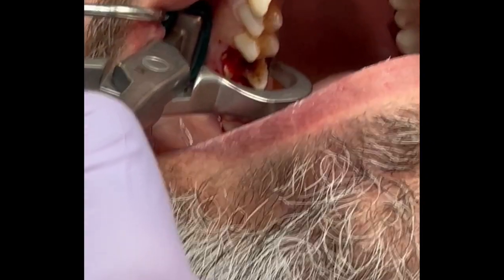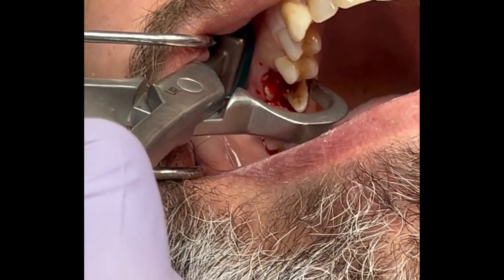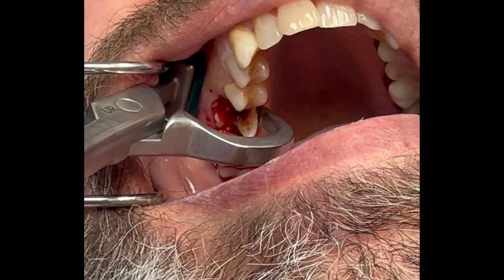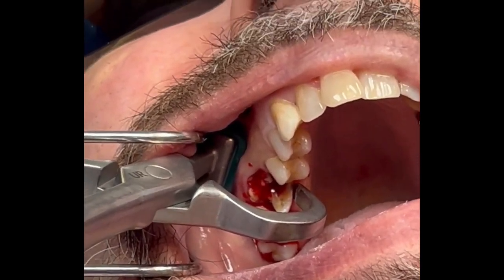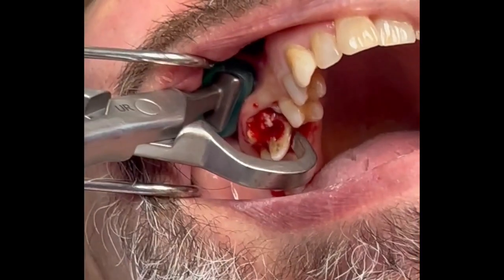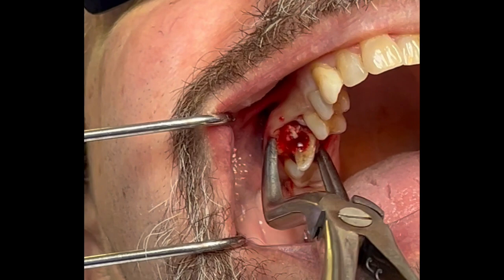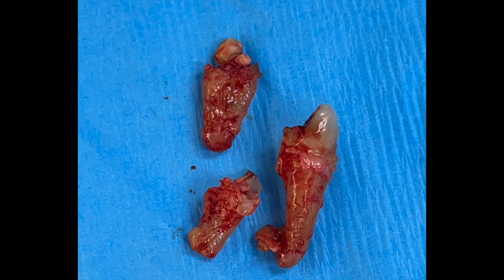It is a simplified approach to socket preservation in preparation for a future implant. Here I'm removing this tooth as atraumatically as possible using the PhysX forcep. I'm going to luxate that tooth and then take a tooth delivery instrument to remove the tooth in total — a matter of seconds with very little discomfort for the patient.